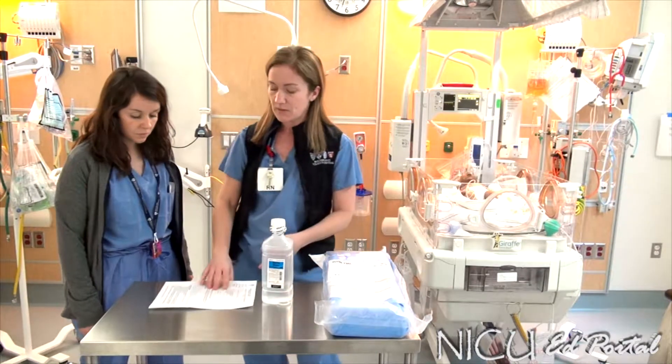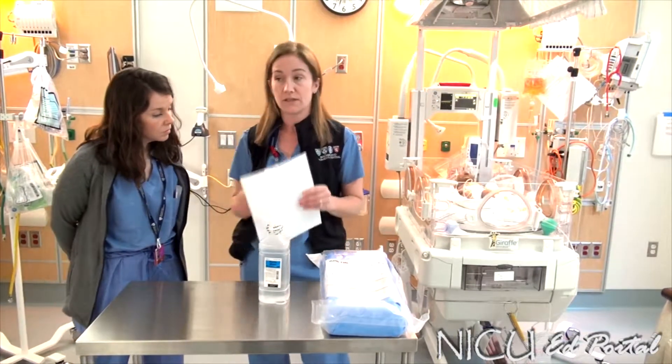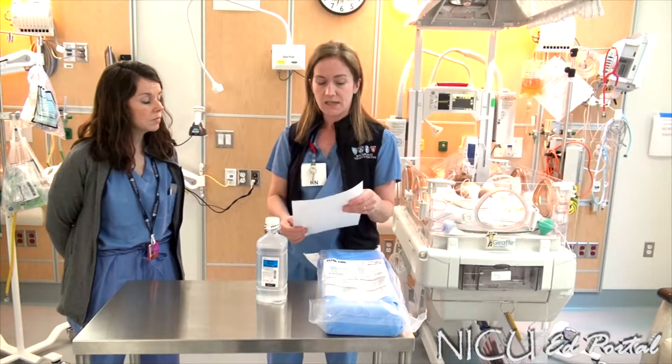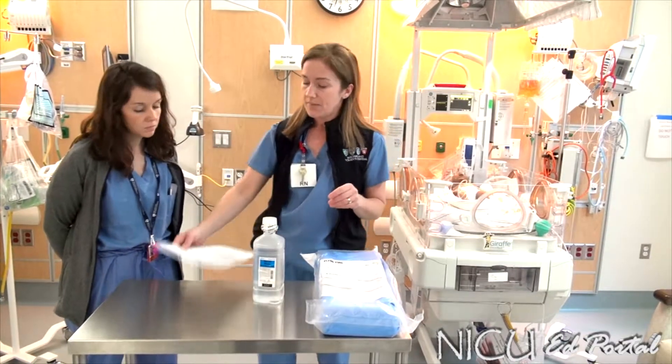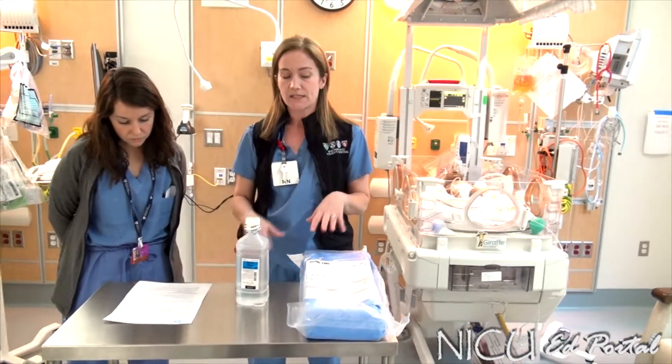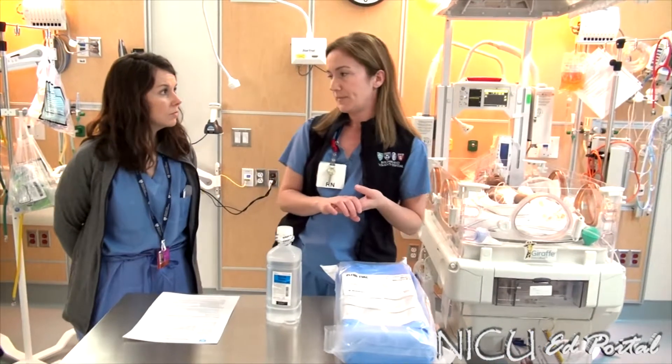First and foremost, any time that you have an infant that's going to need either a thoracentesis or a chest tube set up, you would refer to our nursing policy, NICU C8. In here, it has your policy and procedures that you would need to follow, and it also has the steps on how to set this system up.